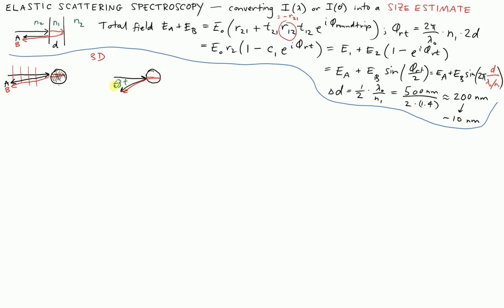So we have angle dependence and we have wavelength dependence. So this one is emphasizing angle dependent changes in the strength of signal that you'll measure, and this one up here was emphasizing lambda dependent. So we have these two things. That's why in the title up here, we talked about measuring intensities versus wavelength, or intensities versus angle.